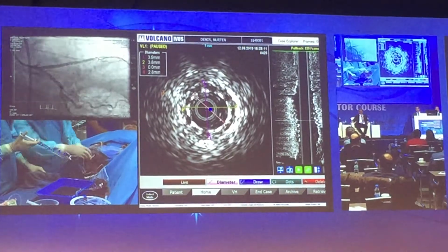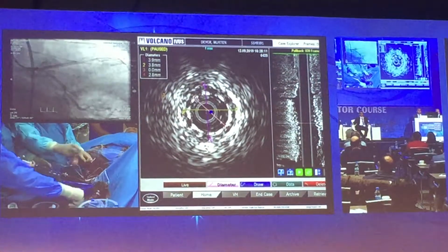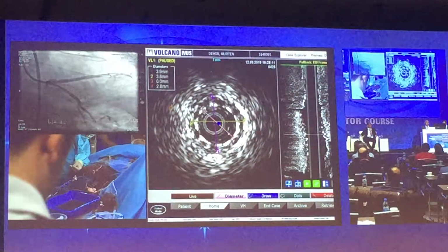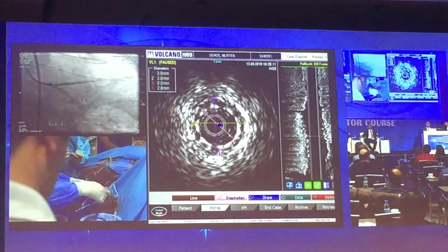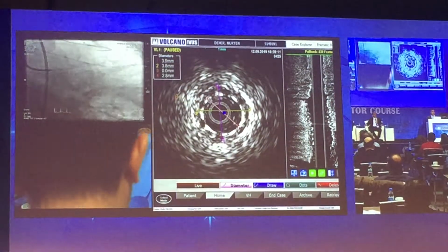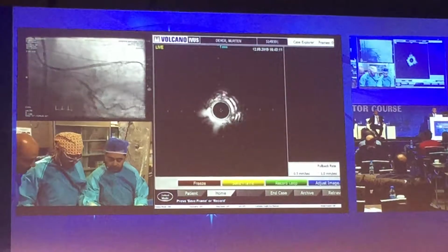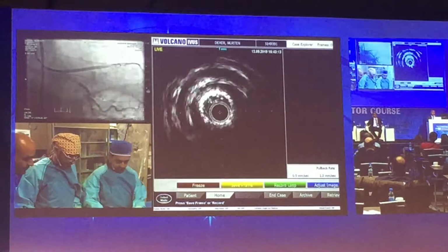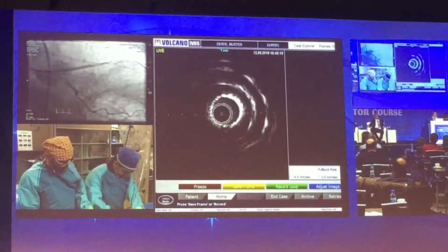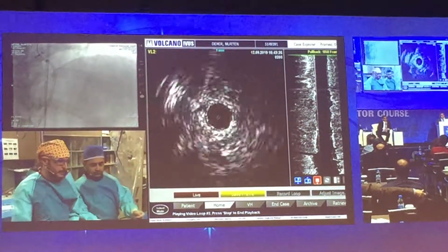A question? Yeah. Yes, I had a question about stent choice. I don't know if there is any special indication for BioFreedom. No, we are already treating the in-stent stenosis, so after the stent deployment, there will be 2 layers of stent, and the BioFreedom relatively has thicker stent struts. Okay. So in such cases, is there any advantage to use ultra-thin stents instead of the BioFreedom? What's your opinion? We asked the same question actually.